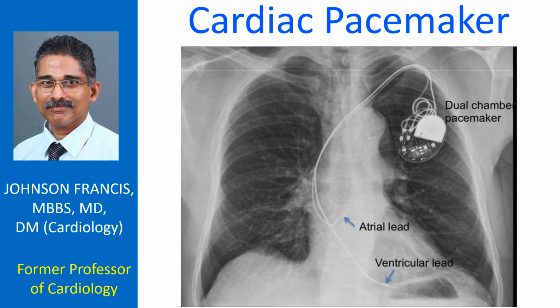Most of the leads are attached to the cardiac chambers using passive fixation structures known as tines. In some instances where lead instability is expected, active fixation screw-in leads are used.